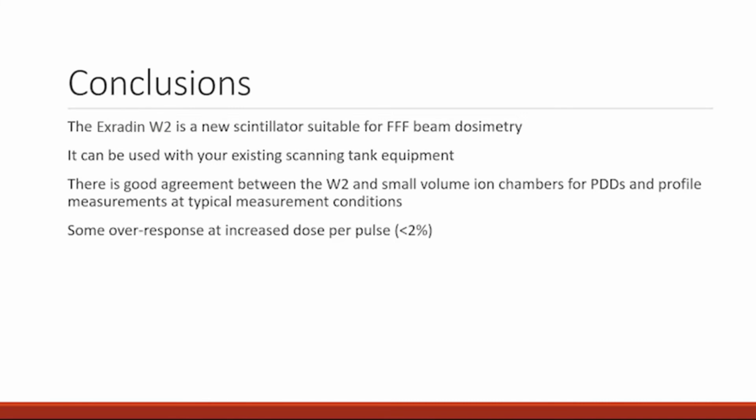We have custom 3D printed holders for our ion chambers. So we simply wrapped it in some tape and it fit in the custom holders. We just put it in and aligned it the same way that we would with the ion chambers, trying to put it at the surface.